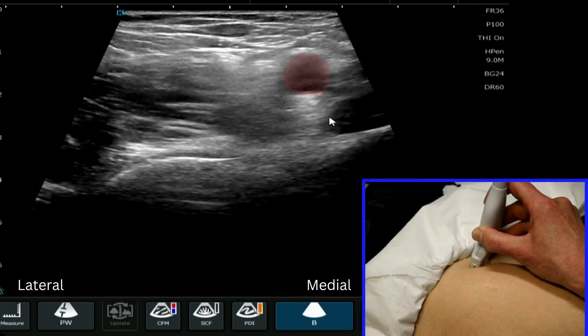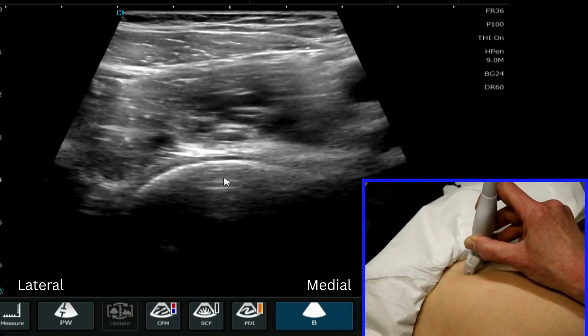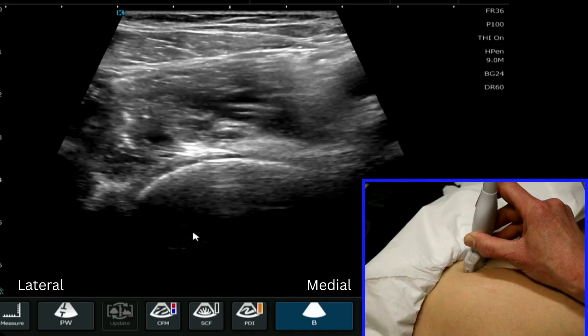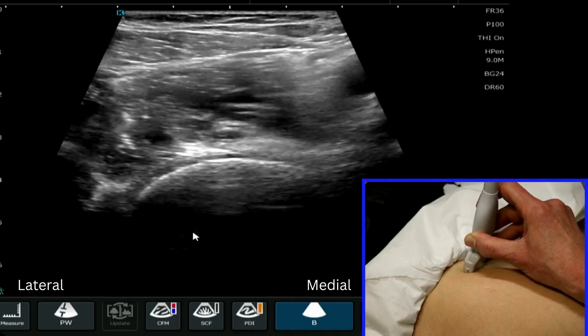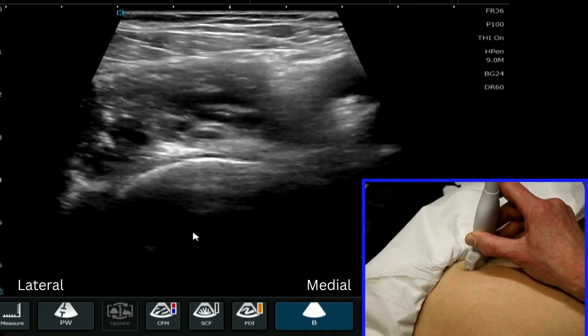You can see the femoral artery more medial to it as well, and then you know that you have your correct landmarks. Now as we discussed before, we then have to angulate the probe for the longitudinal image so that we get the right image when we scan it.